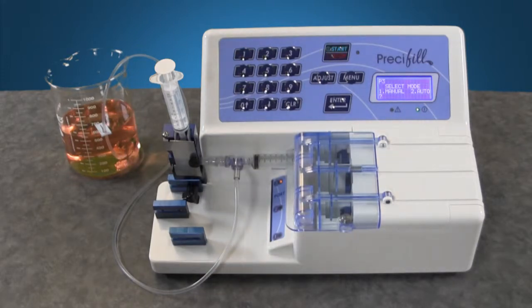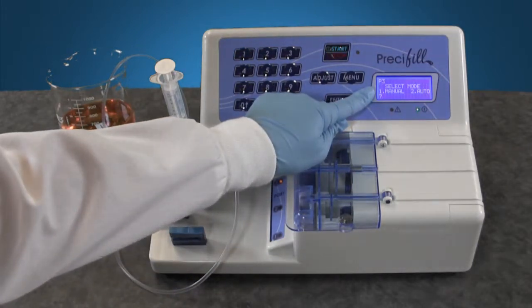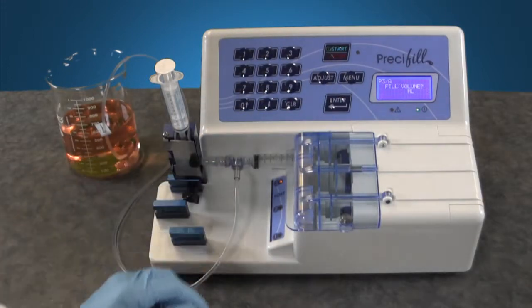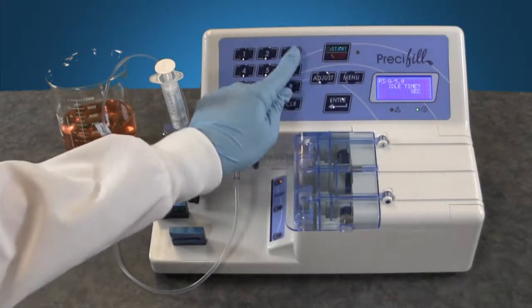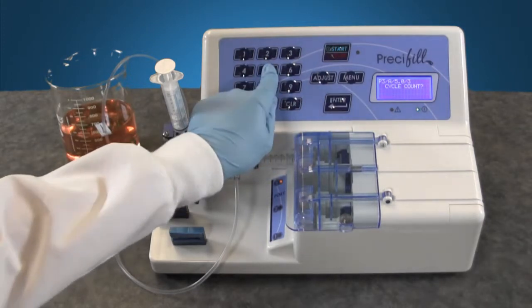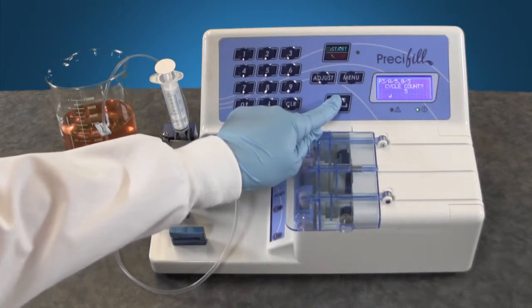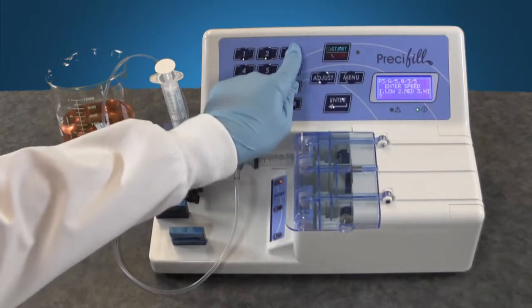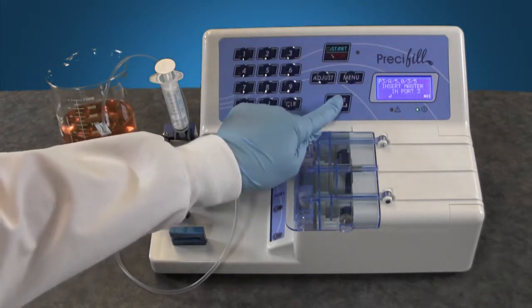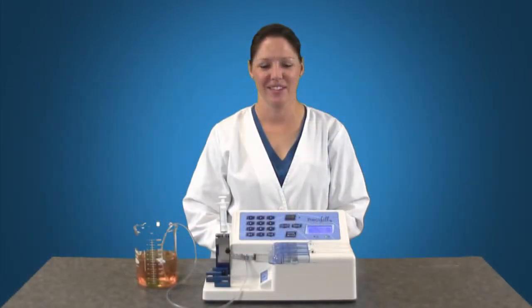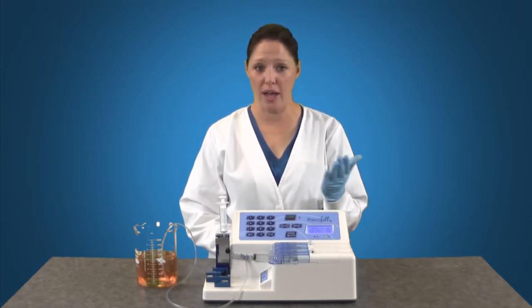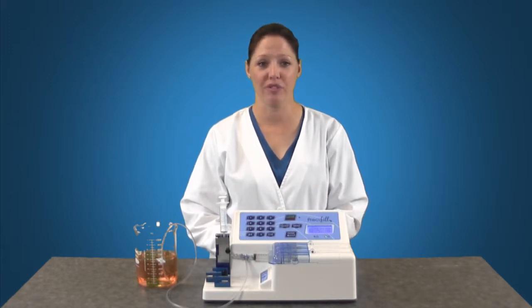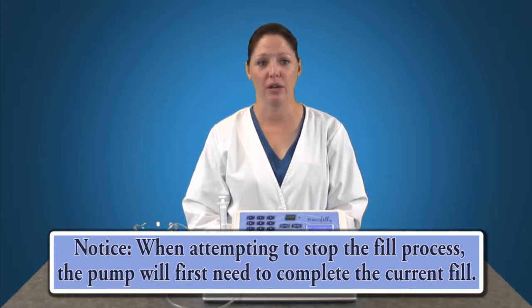To fill in automatic mode simply select automatic from the select mode screen. Press 2 and enter. Enter your fill volume 5 mil and enter. Idle time between fills 3 seconds and enter. The cycle count which is the number of total dispensers 5 and enter. And the speed 3 for high and enter. Once ready press the start stop button and the pump will fill the total batch. You can stop the batch at any time by pressing the start stop button and resume filling by pressing it again. It is important to note that in order to stop the fill process the pump needs to complete the current fill.